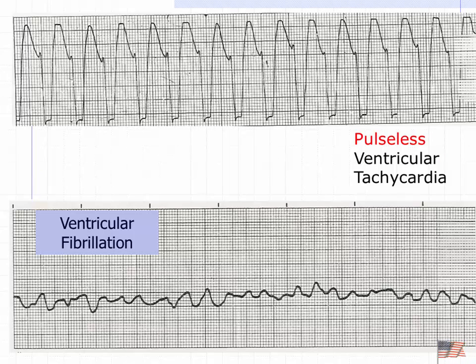So, unless I know that there's a pulse, I don't know what to do next. I need to assess for a pulse. We're going to treat that pulseless VTAC just like we treat this.